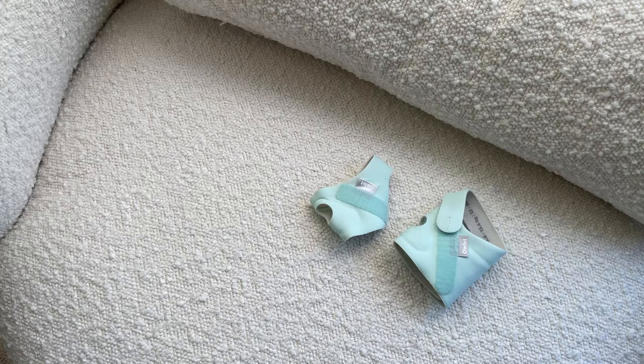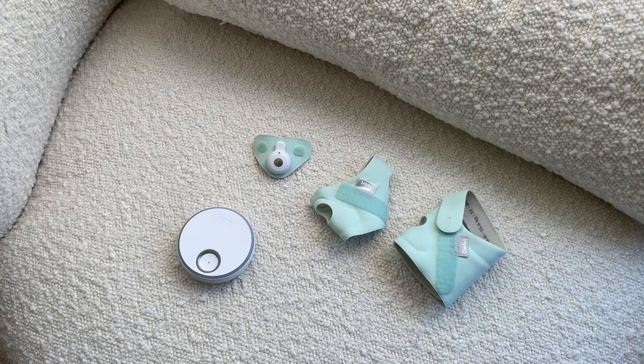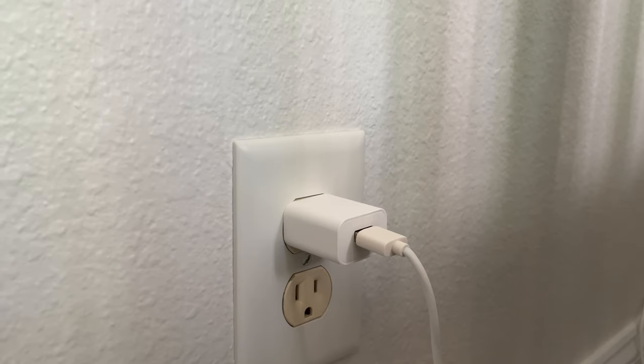In the package you get the four socks, the sensor that you put in the sock you're using at the time, and the charging dock as well as the charging cable. If you have the duo system, you'll also get the two-way video monitor camera and its power adapter.